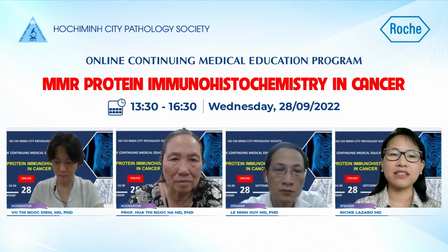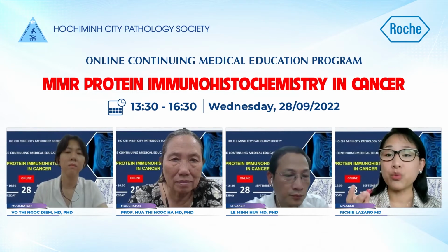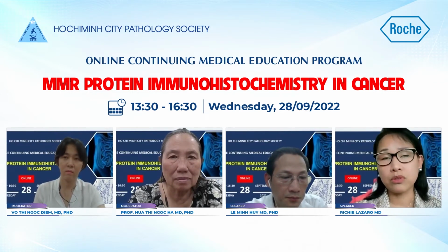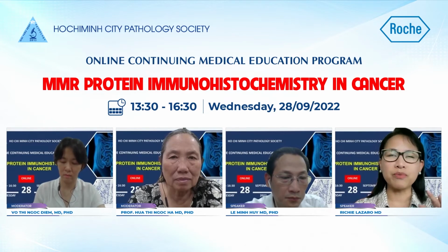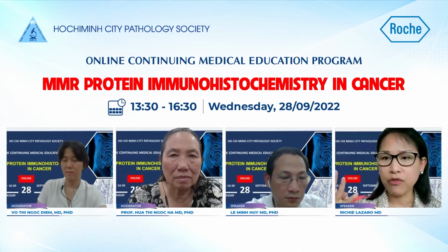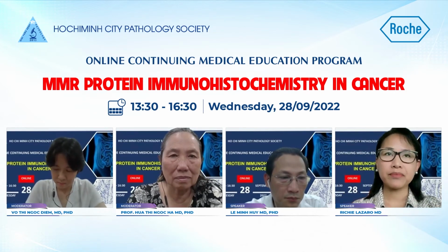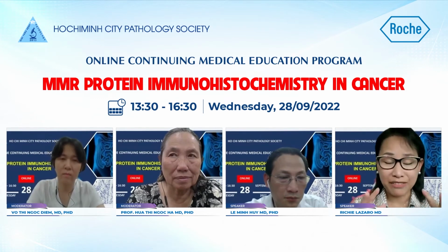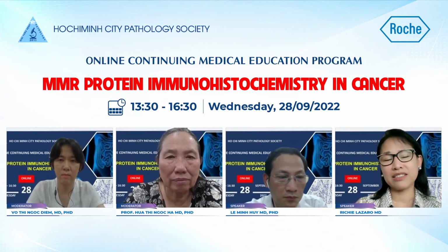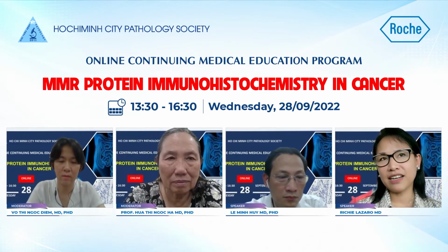And then see, because chances are if MLH1 is abnormal, almost always the PMS2 is also lost. So in these cases, although I would still recommend 4 antibodies for MMR immunohistochemistry, if I have limited tissue, I might just cut it to 2 antibodies. I mean, that's one possible way to manage.